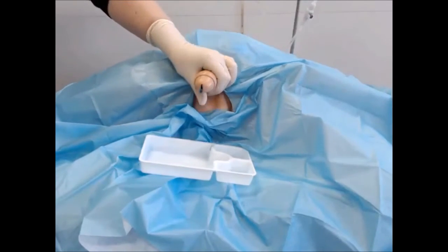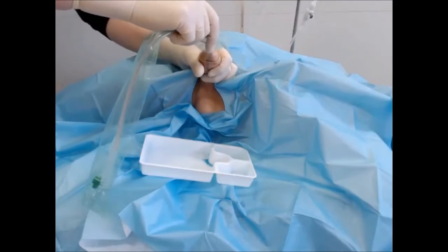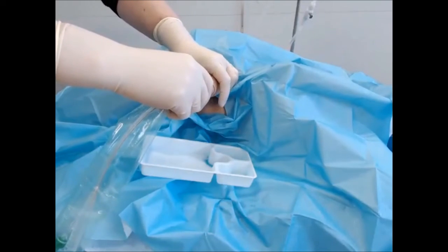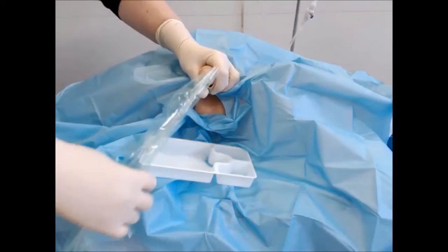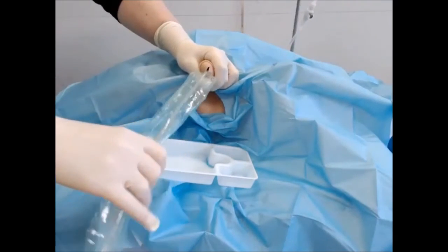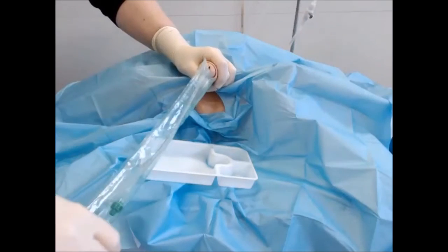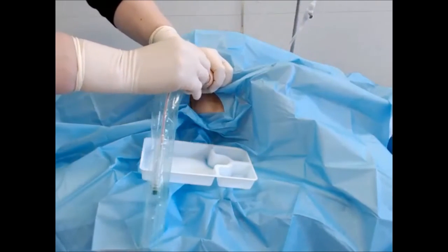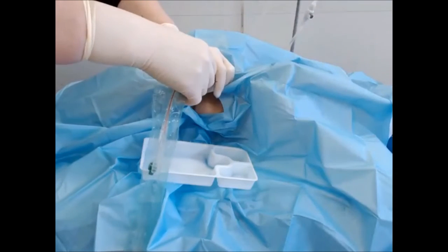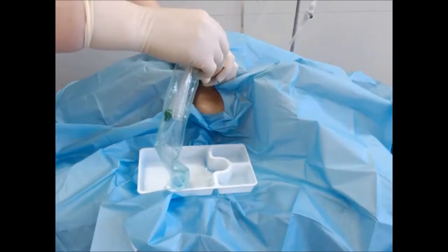With your catheter open and everything ready, put the penis close to 90 degrees and insert the tip of the catheter into the meatus. Then put the penis down parallel to the ground, and if you pull slightly towards the patient's toes, you will straighten out the urethra and make it easier. Keeping the catheter in the pack, pass it through the urethra until you meet resistance — try to relax your hand while doing this. That resistance is the prostate. Maintain catheter pressure against the tip of the prostate and it will pass through. The more lube you've used and the more traction you apply to the urethra, the easier it is. You know you've passed through the prostate when urine comes into the bag.